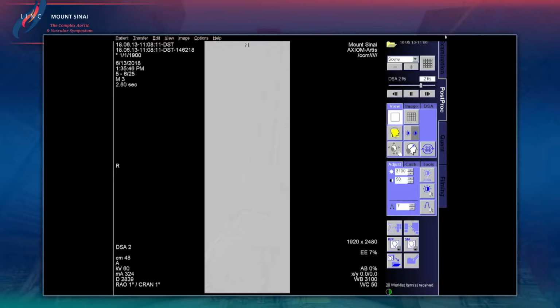seen. So at this stage, I think the problem with him is he has very severe disease, with the peroneal artery being the dominant flow, filling first, with very significant disease both in the AT and the PT. The PT seems to be filling via collaterals from the peroneal, as you can see in that injection right there. But I don't know if that's a named or unnamed branch at this stage.